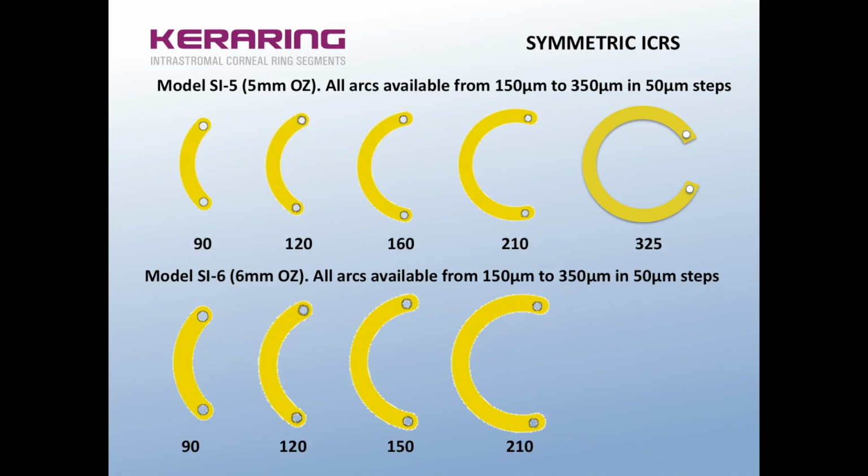the patient. There are many available intrastromal rings today, and the parameters that distinguish them from each other are basically the diameter, arc, and thickness. For what concerns the diameter, we have the possibility to choose between a diameter of 5 mm and 6 mm, and this choice is dictated by the mesopic conditions of the patient's pupil so as not to create too many nocturnal aberrations and halos around lights.